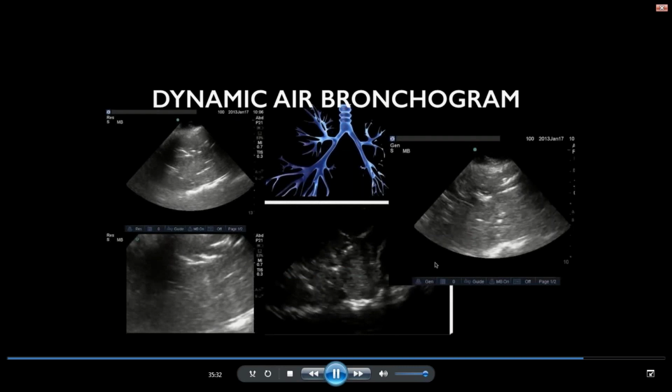Let's move on to understanding the air bronchogram a little bit better, because this can come in very handy at the bedside to make a quick diagnosis. Now, your best bet of picking this on ultrasound is if this is subpleural or more peripherally situated. In instances of posterior consolidations, or if it's very deep in the lung tissue, you may miss it on ultrasound because you may just see an overlying A pattern due to the normal lung. Okay, but here's what classic air bronchogram looks like on ultrasound.